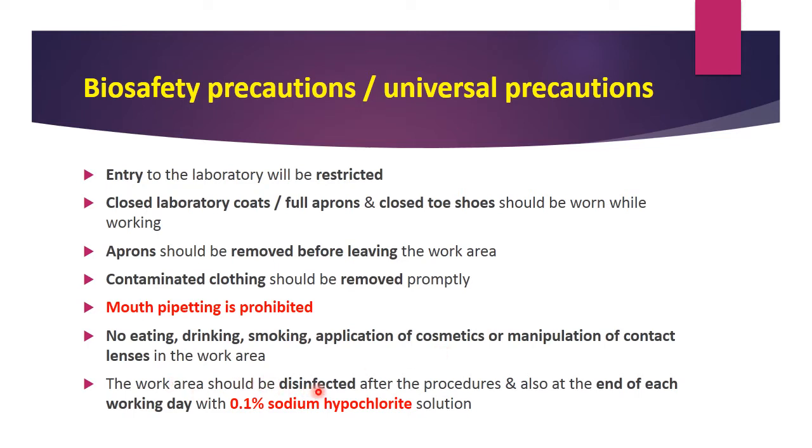The work area should be disinfected after the procedures. See that the disinfection is done soon after each procedure and also at the end of each working day by using a particular disinfectant called 0.1% sodium hypochlorite. So this particular disinfectant you have to use soon after your procedures. Clean it using sodium hypochlorite and also at the end of each working day.